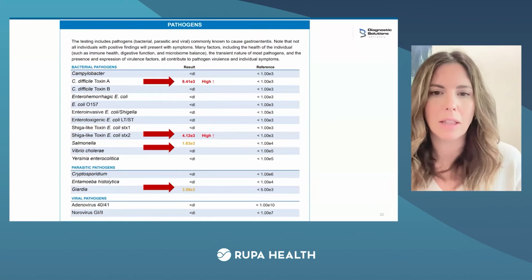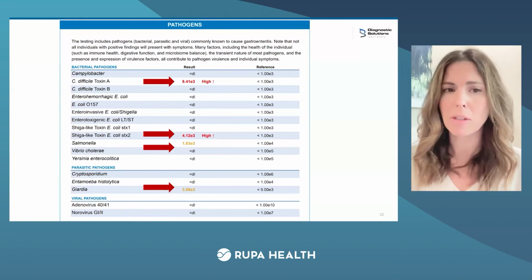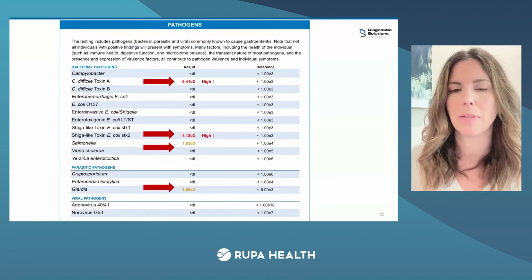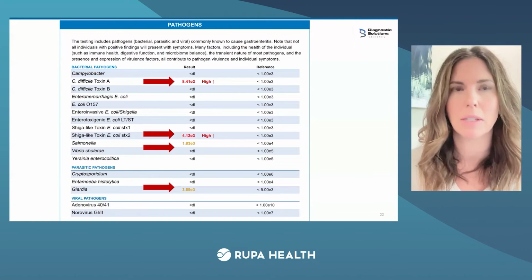A lot of these are at levels, I would say actually all of them are at levels below the threshold at which they would show up as a clinical infection. Something like that C. difficile there, where we see C. diff toxins starting to be positive and, say, extreme diarrhea and hospitalization, is going to be around the E7 level, or in the tens of millions.